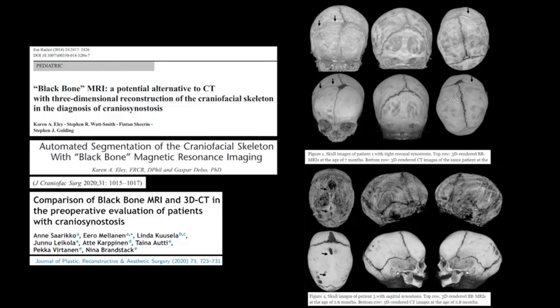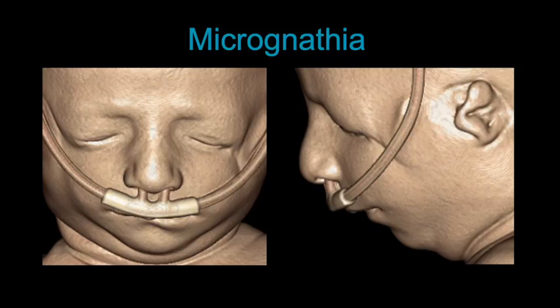There is a greater likelihood of image degradation due to motion in awake patients. MR is more costly, and a significant amount of time is required for accurate segmentation in order to provide these 3D models. However, more recently, automated segmentation techniques are gaining acceptance. Lastly, these 3D MRI techniques are less reliable in very young infants in whom the bone is thinner and in patients with very prominent convolutional impressions where there are focal areas of thinning.